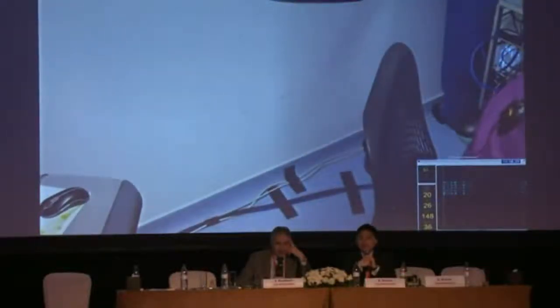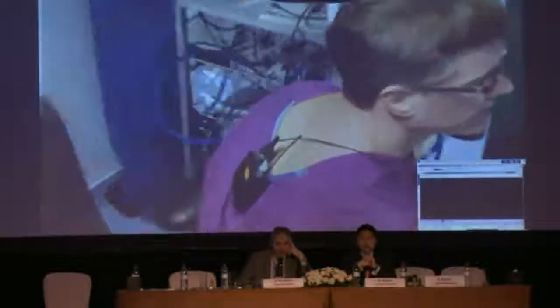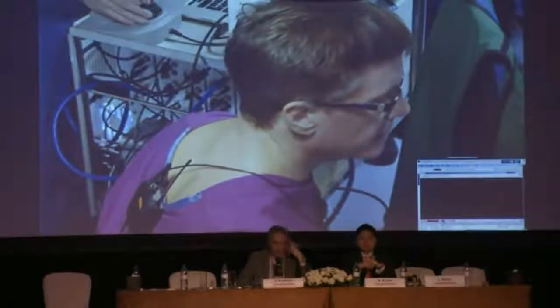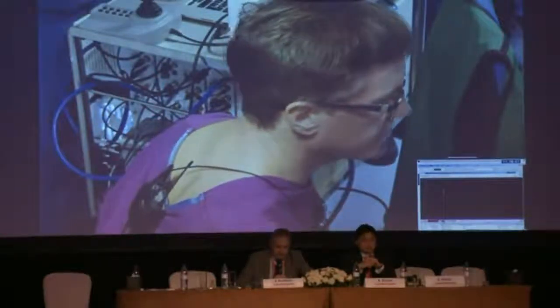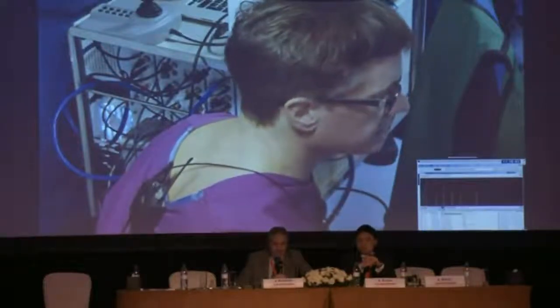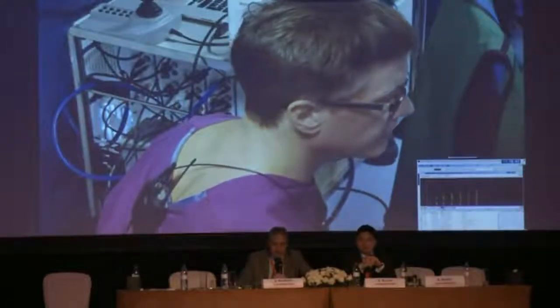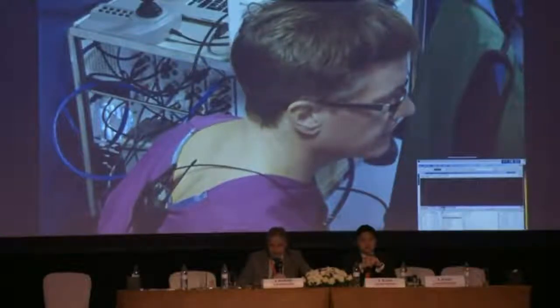I did. It's a good question. So really the key is, it's not the speed of the AF so much as the pattern recognition. So if you can see patterns in it, then you're in business. So let me try and give you an example. I'm just trying to show you the signals here.